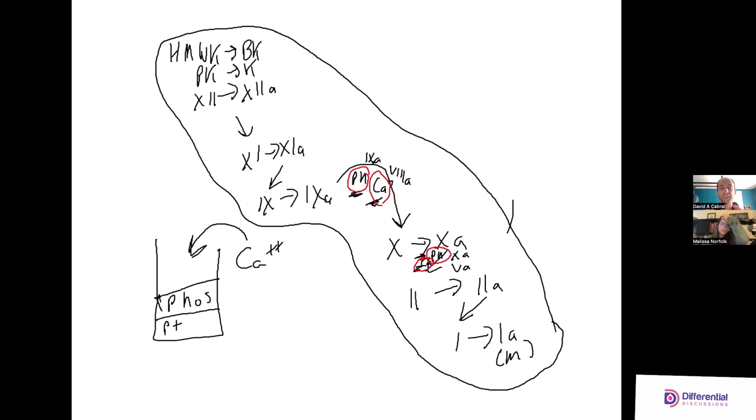So both methods have good things and some bad things. The optical methods typically have color interferences and things like that that can come up, lipemia is a big one. Whereas the mechanical detection doesn't have those same limitations as much, right? But low fibrinogens or fragile fibrinogens can easily be broken up by the mechanical method. So both have pros and cons, and in part it depends on the patient population which methodology is going to be better.